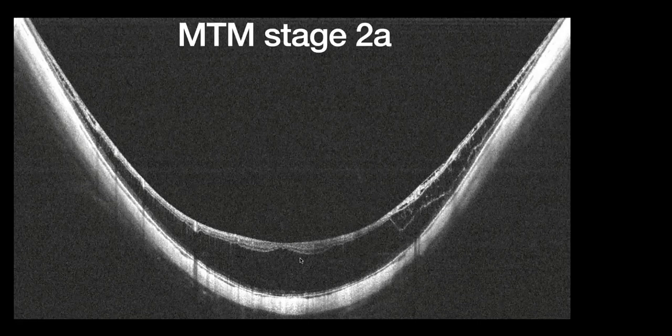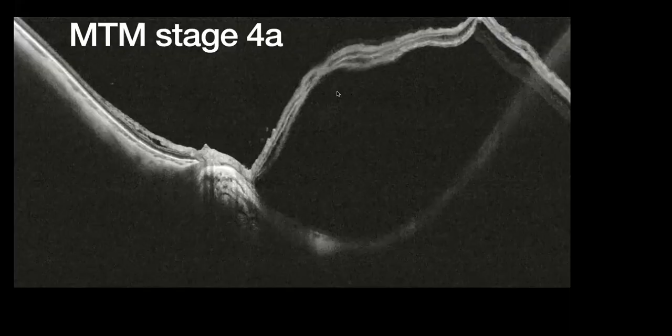Another example. You look at the macula, and here there is not so much contrast, but there is retina inside here with the deep schisis. So this is stage 2, because there is no detachment. The fovea is intact, so this is stage 2A. Look here, the macula is completely detached, but the inner fovea is intact. So this is stage 4A.